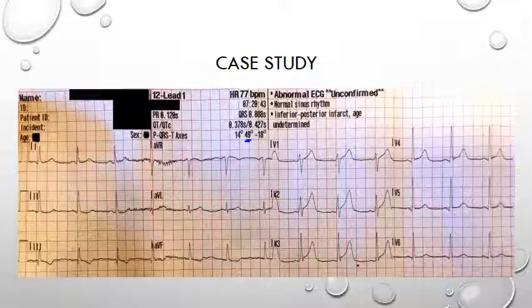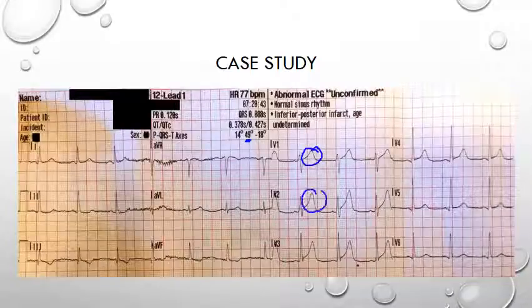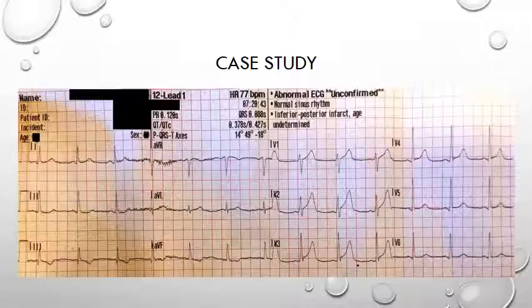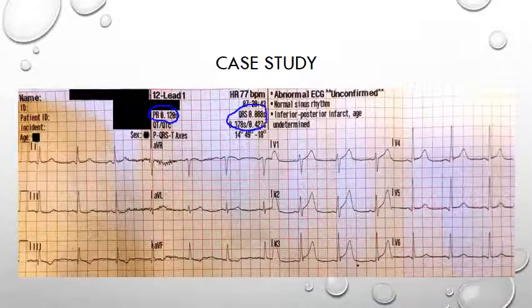The P wave morphology looks normal as does the QRS, but the T waves are large anteriorly. Looking at leads V1, V2, and V3, the T waves there are quite large — and we'll come back to those as this video is about hyperacute T waves. The PR, QRS, and QTc are all within the normal range, as shown by the computer measurements.